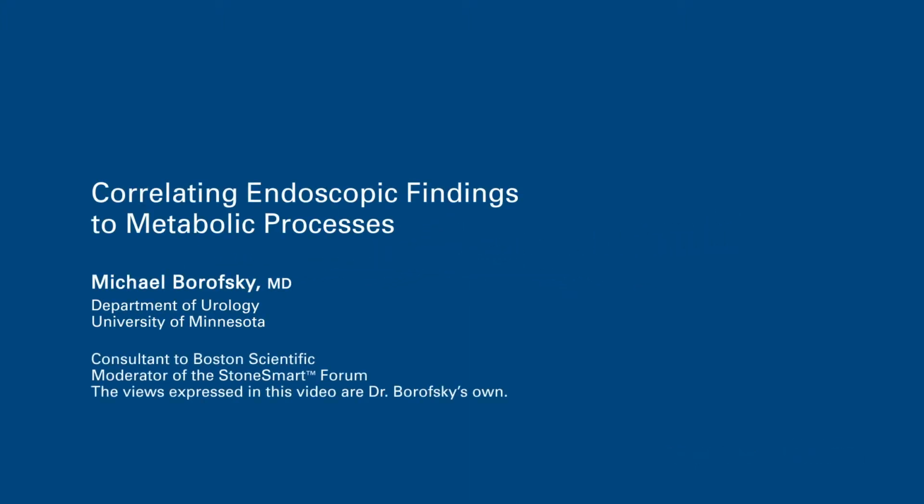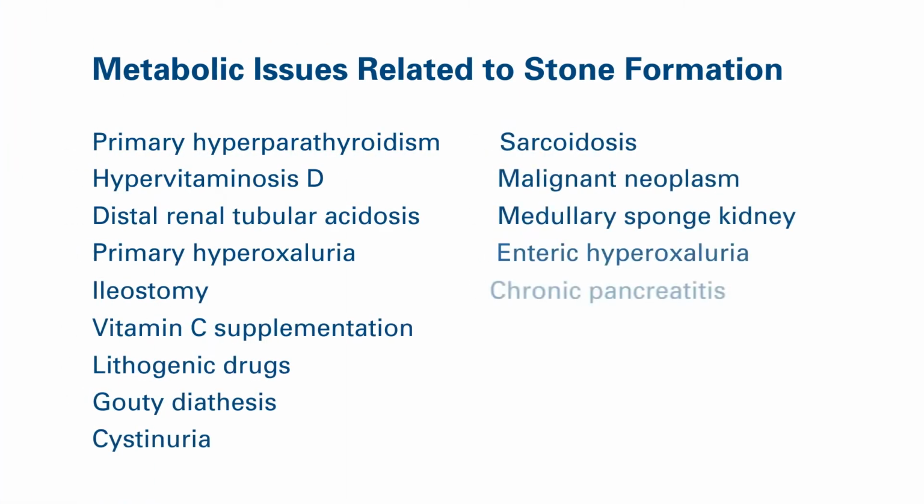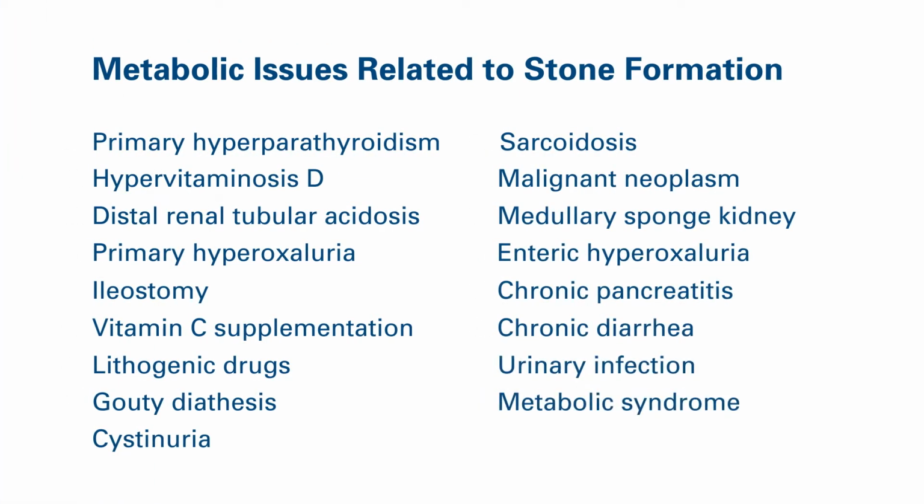For the last 20 years, minimally invasive kidney stone surgery has all been about the stone. And we ignore the papilla. We ignore the birthplace of the stone. And we may be missing out on a lot of information that could potentially help the patient in the future. Most kidney stones are, I would argue, the endpoint of a variety of different diseases, and we lump all of our patients together, but they may actually be quite different from one another.